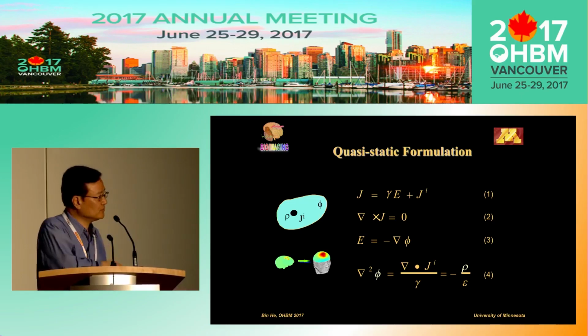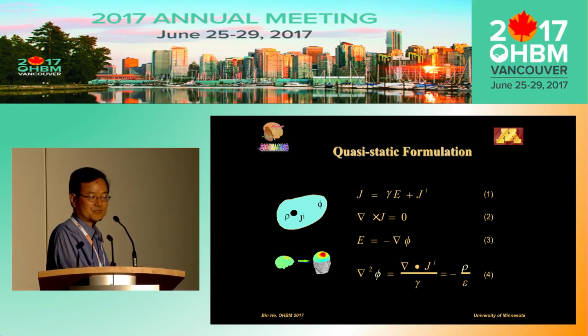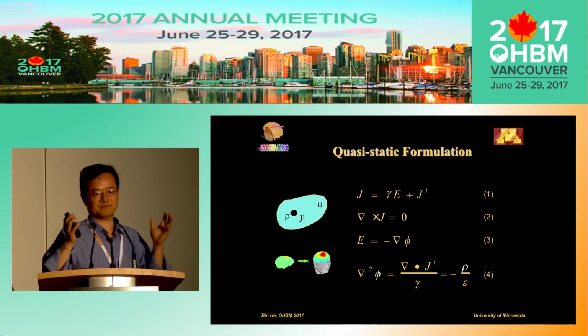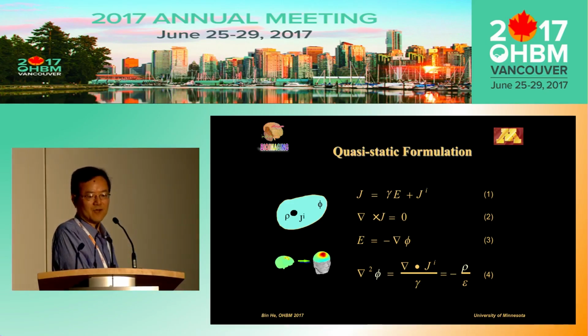Now, one thing I do want to bring to your attention, with this cartoon which I made personally many, many years ago, is that the forward problem actually illustrates the need for the inverse problem. If you have three point sources, say three cortical areas being activated, through volume conduction you only see one large area of activation over the scalp, which means that volume conduction is essentially a low spatial pass filter. It filters out high frequency information, it filters out lots of useful information, but anyway, that's what happens, and why this is the case.